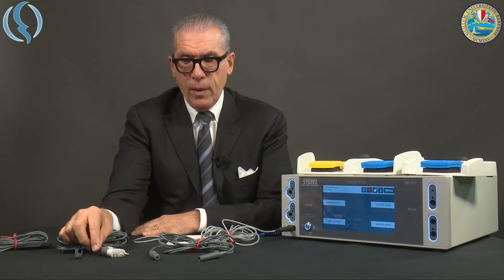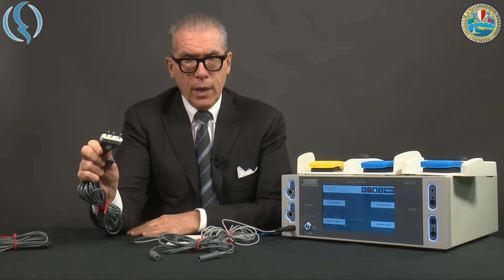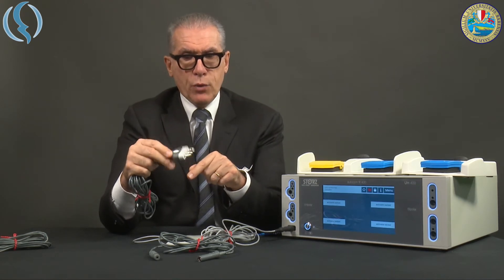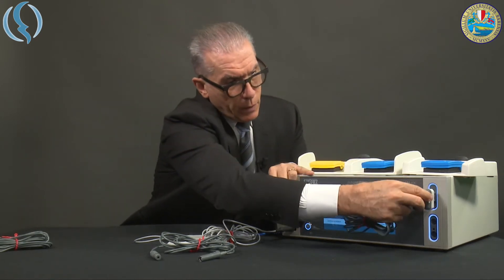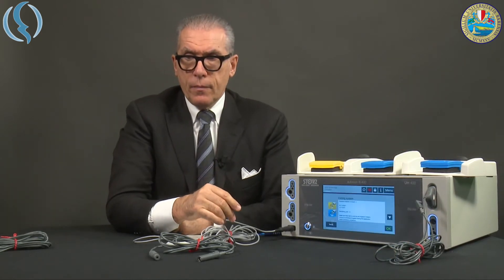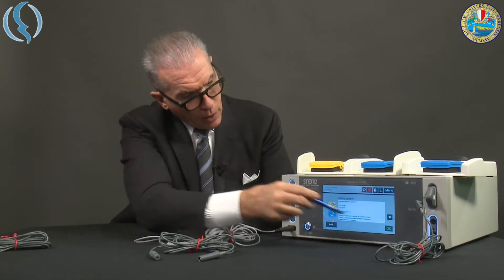Here we have this kind of body that contains a chip. When we plug this in, the machine recognizes — by reading the chip inside — which instrument will be connected. It's a special mode dedicated, in this specific case, to resection. In fact, you see the machine tells you which instrument has been connected.